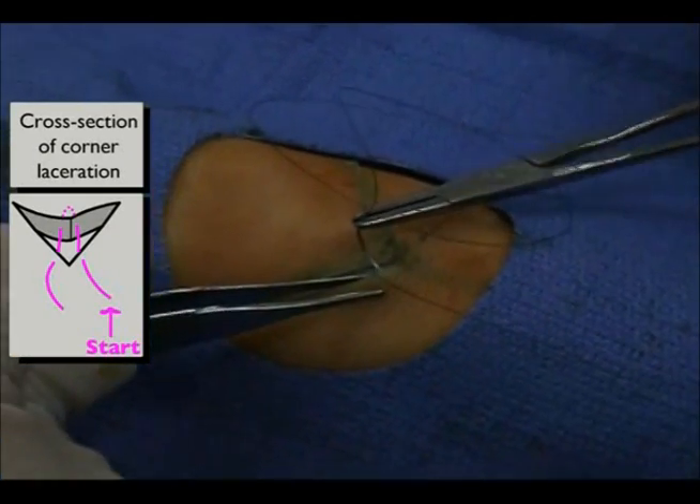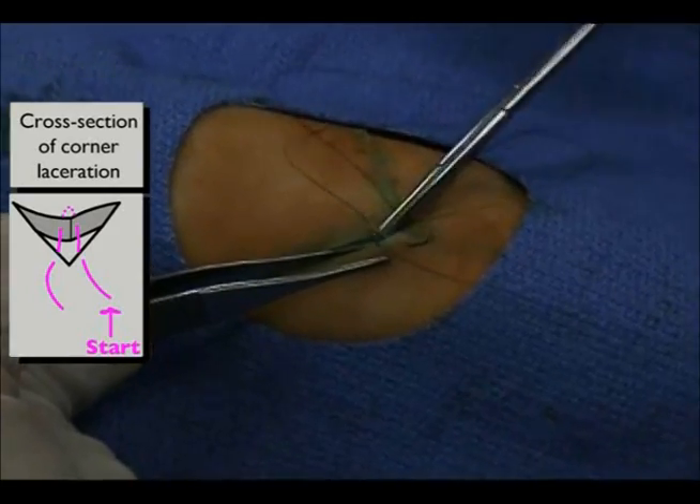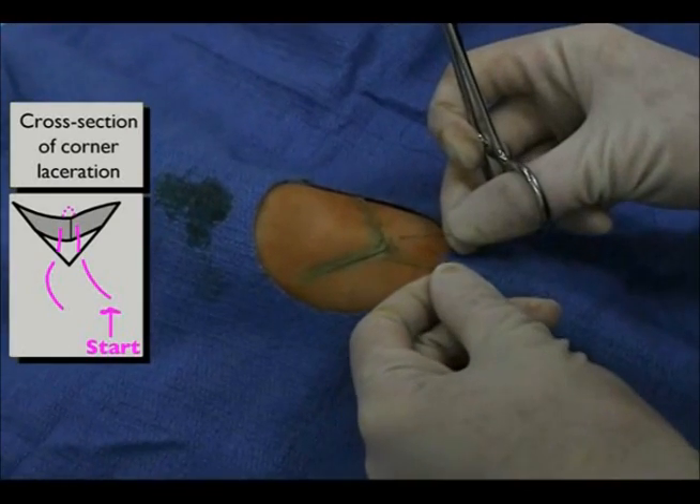Next, reload the needle on the driver. Insert and advance the needle through the last wound edge at the same depth that you exited just prior. The needle should exit through the intact skin.